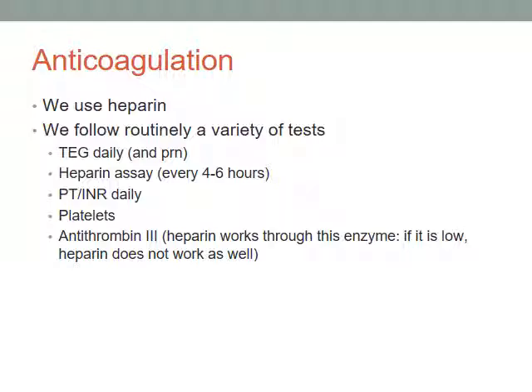And by the end, we had her on warfarin, I think Plavix, and definitely heparin. And the heparin assay we kept not 0.3 to 0.5, but 0.7 to 1. So we had her on high doses of everything to keep the circuit from clotting.